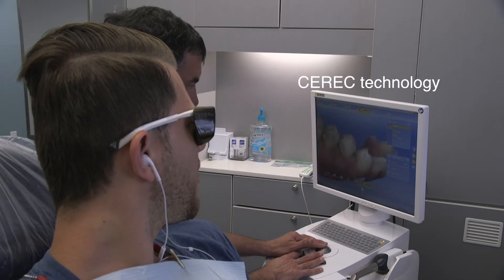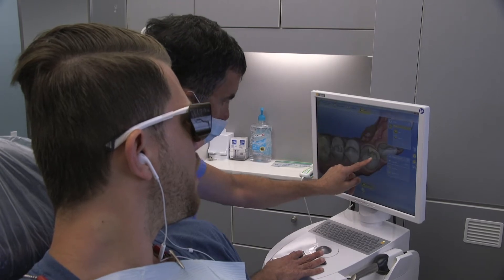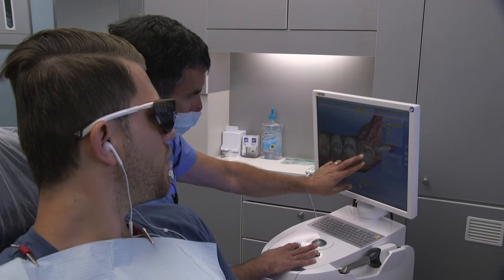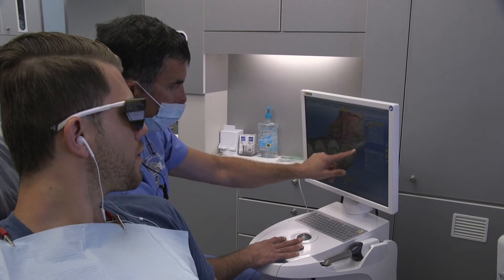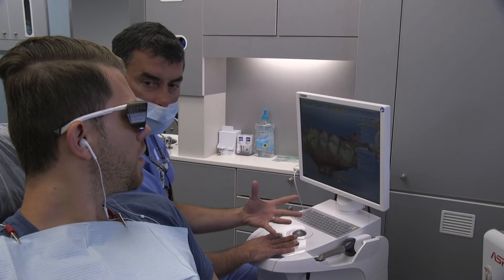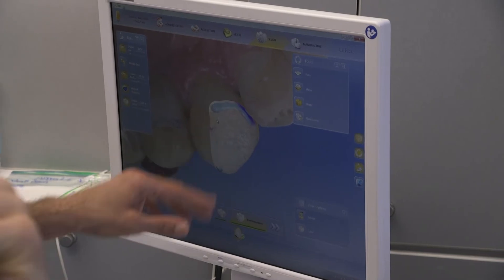With a normal veneer they cut all the outer wall off — wow — and then it wraps over to part of this, but the business end of what we were dealing with was right in here, just building up that tooth a little bit. I left all this still natural, and now we're just making a porcelain ceramic insert.